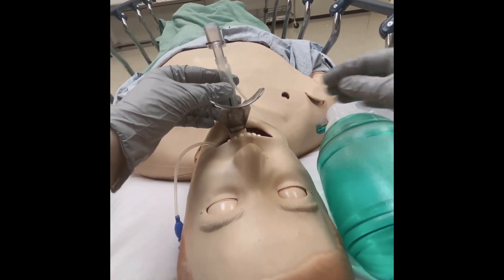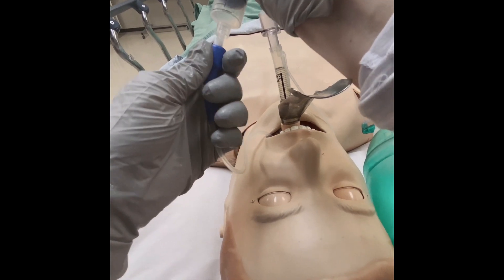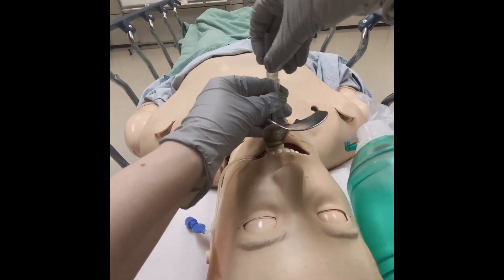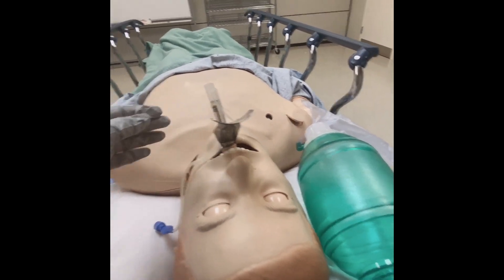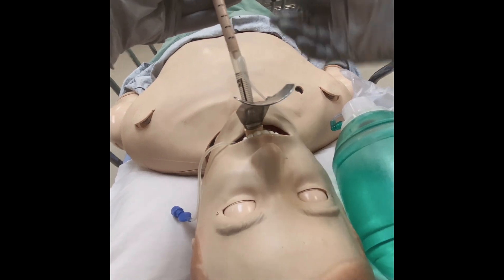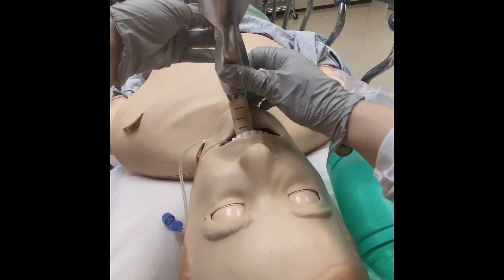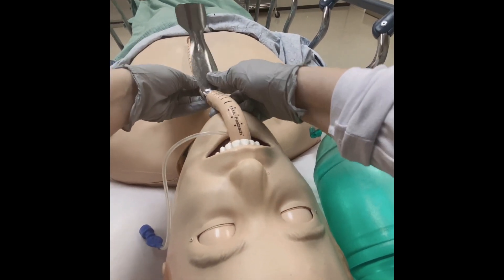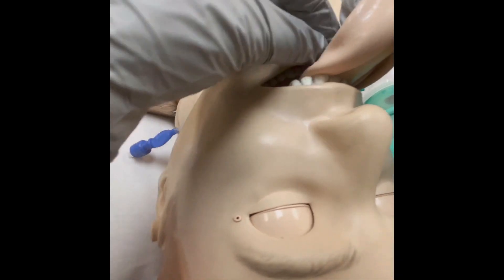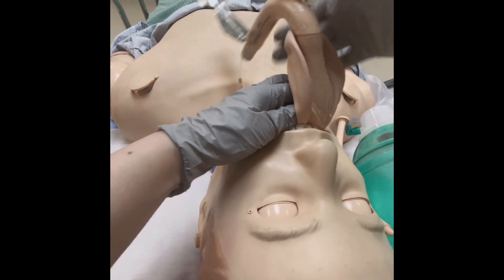Once you have confirmed placement of the ET tube, you're ready to remove the LMA. First, deflate the LMA cuff. Next, remove the BVM connector device from the ET tube. In order to remove the LMA, you need to keep the ET tube in position with the stabilizing rod. While pushing the stabilizing rod with your left hand to hold the ET tube in place, remove the LMA. Once you can see the ET tube, stabilize it with your hand. You or your assistant will need to remove the stabilizing rod from the LMA before taking it out completely.